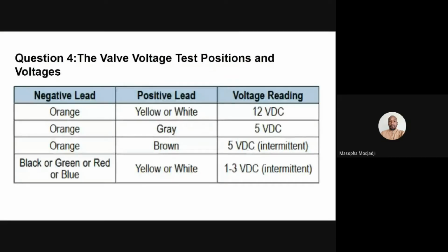Sometimes the problem can originate from the control board. The 2 revolving discs inside the valve are controlled by the step motor, which is powered and controlled by the control circuit board. Therefore, you need to check the voltage of the stepper motor windings to determine if the problem is in the control board or your valve. The voltage can be checked either on the wire harness connectors on the valve or on the printed circuit board using a voltmeter.